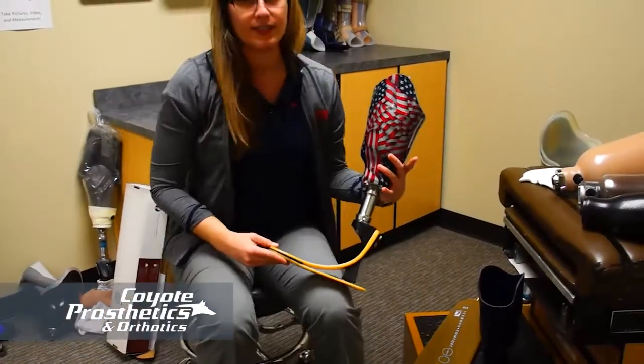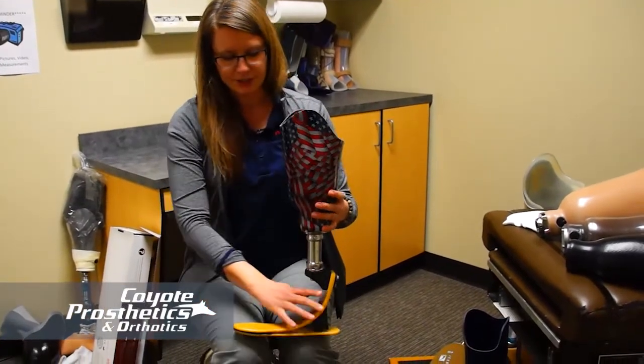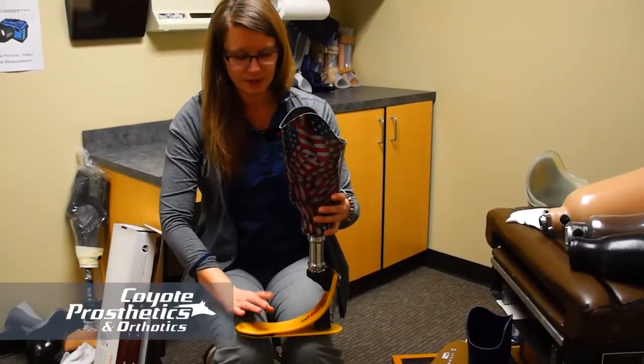So this is a prosthetic foot. There are many, many different types of prosthetic feet. And generally you'll have an inner part of your foot, which is this.